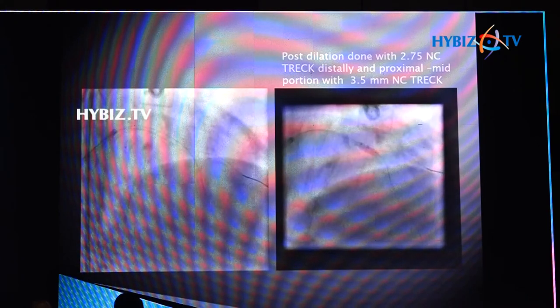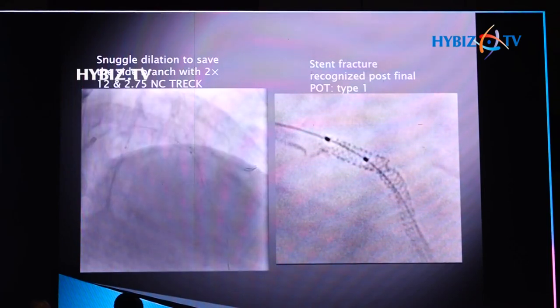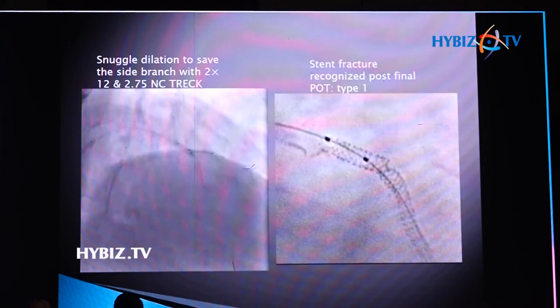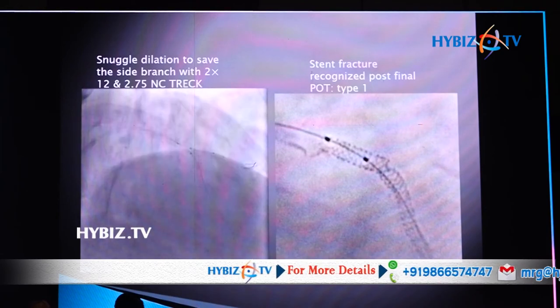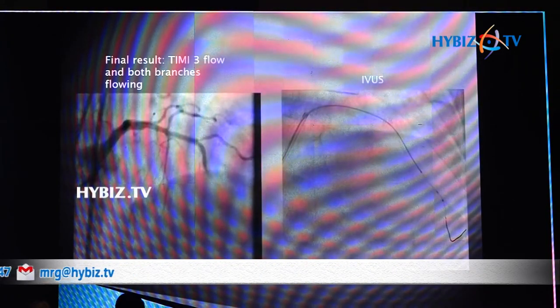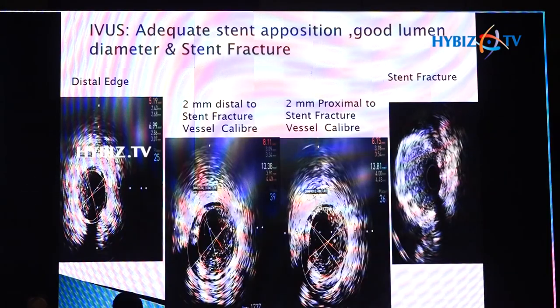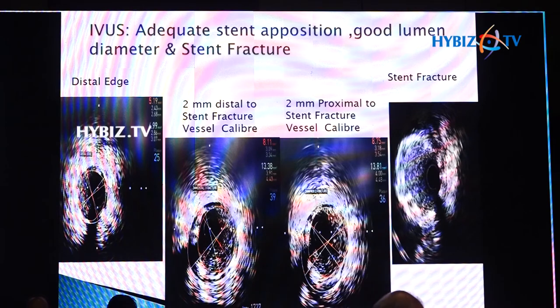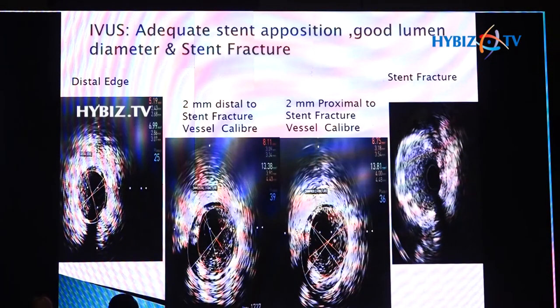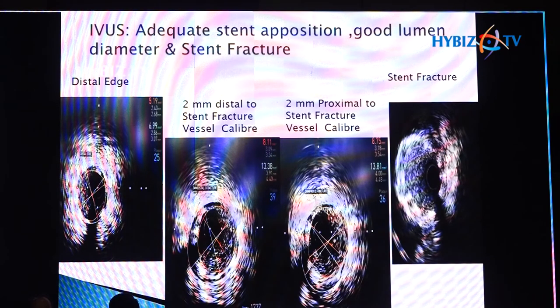We decided to do post-dilatation, performing a 3.5 balloon dilatation. This is a snuggle balloon dilatation to prevent the diagonal going down — a 2 mm balloon in the side branch and a 2.75 NC track in the main vessel. On the stent boost image before the final shot, we could see a fracture at the bend where the struts had separated. Although everything was fine and both branches were flowing well, two days later we did IVUS. The IVUS confirmed adequate post-dilatation, and at the area of stent fracture between 12 to 3 o'clock position, the struts were not visible. This was a Type 1 stent fracture, so we decided nothing further needed to be done. She remains fine.